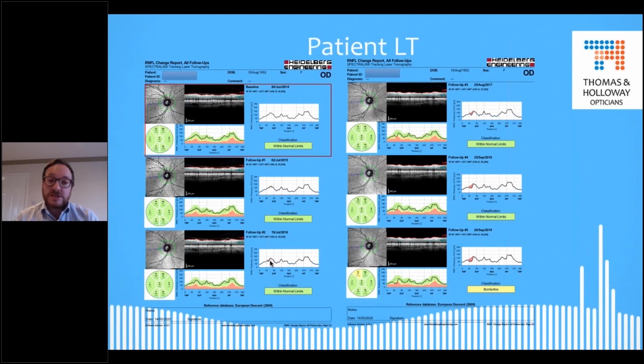She's only 66 years old now, so who knows, this patient might have another 20, 30 plus years ahead of them, and we need to keep that right eye as healthy for as long as we possibly can. So I actually built up the picture a little bit more and sent it to an alternative ophthalmologist. It happened to be a private ophthalmologist in her case. They sent it for a second opinion, if you like, and that's when they had a bit more evidence in terms of the RNFL progressive notch.